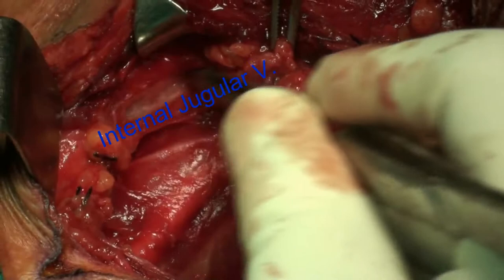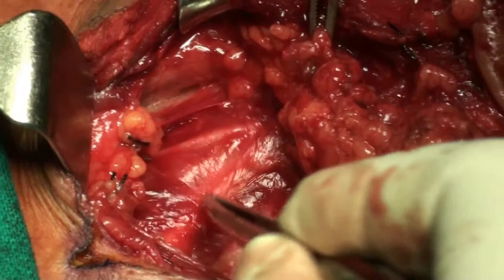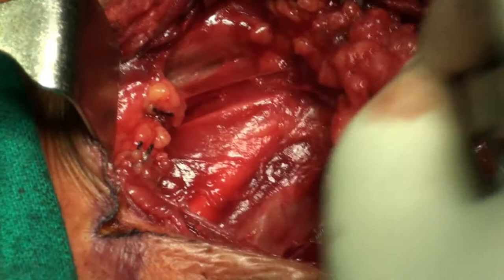So we got down to the posterior triangle completely. That's the phrenic nerve here. And that's the safety layer. And that's the brachial plexus. This is scalenus anticus, medius, levator scapulae, splenius capitis would be higher.